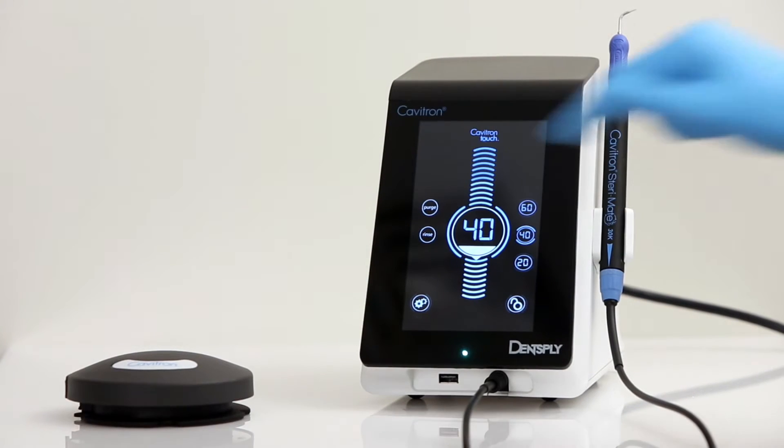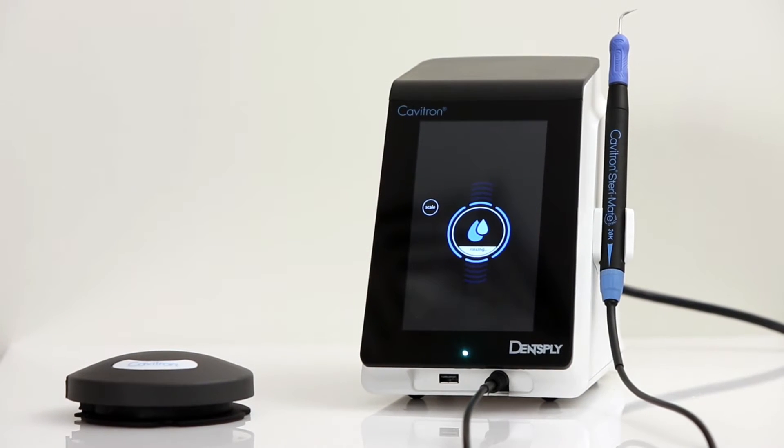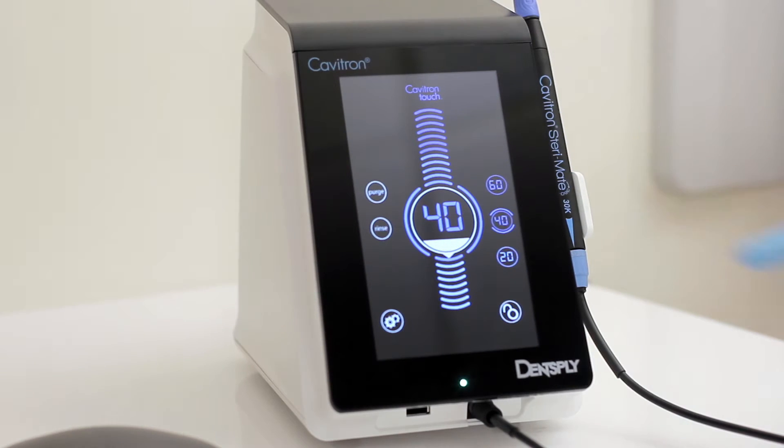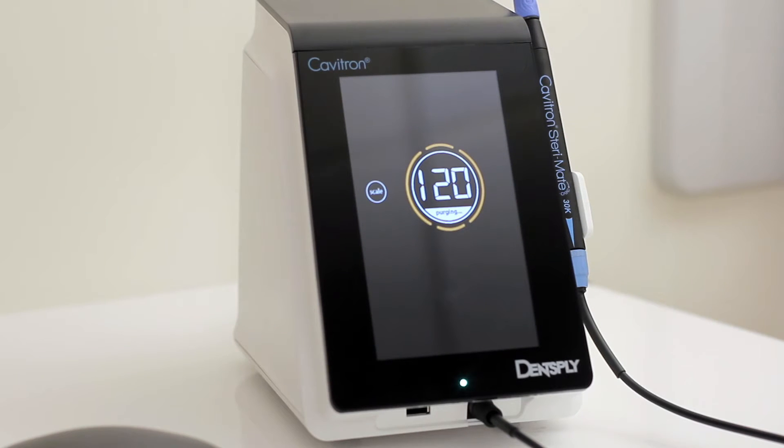The rinse icon is tapped to allow use of the handpiece for lavage only, without cavitation of the insert tip. The purge icon is tapped to access the feature which activates continuous water flow through the handpiece for 120 seconds, the suggested time to purge the water lines at the beginning of the day.